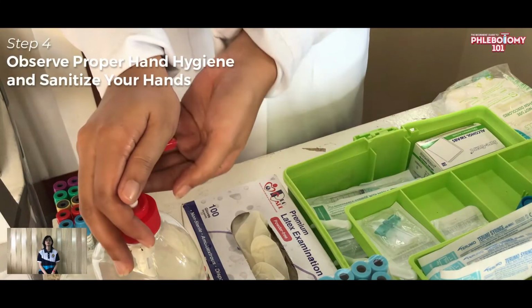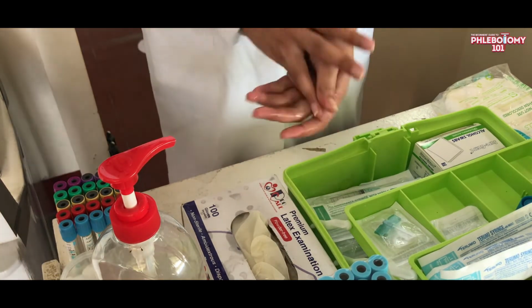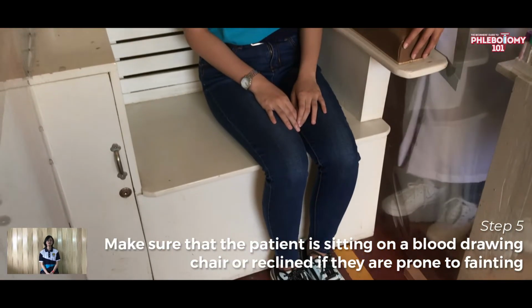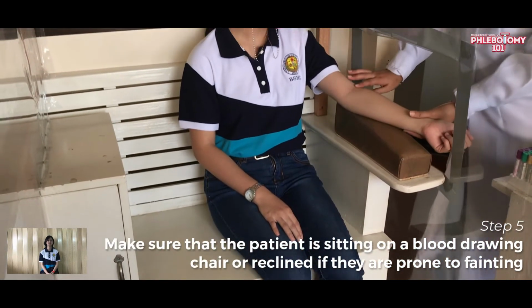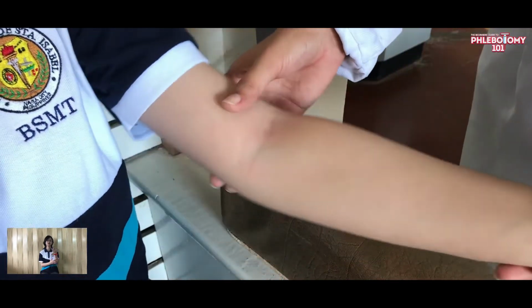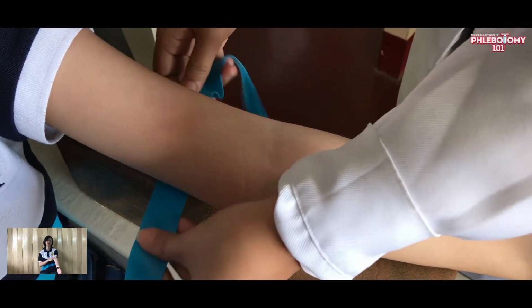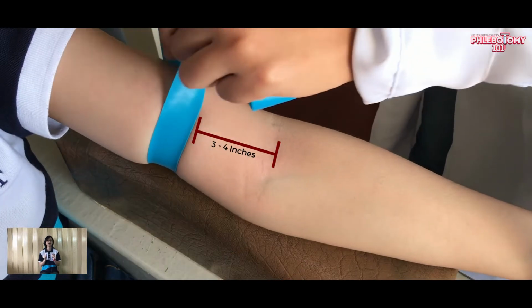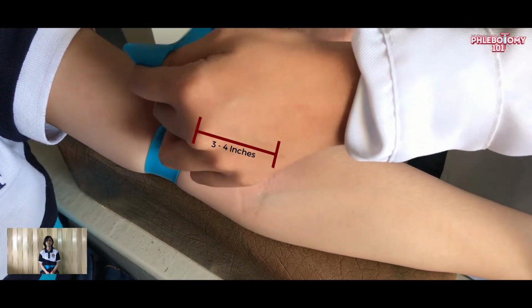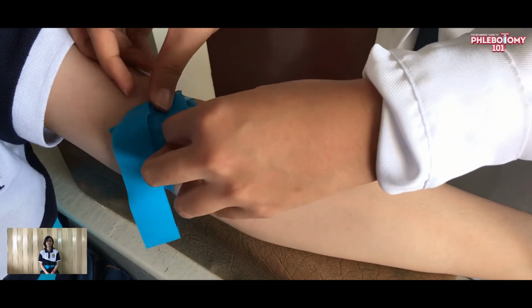Step 4. Observe proper hand hygiene and sanitize your hands. Step 5. Make sure that the patient is seated on a blood-drawing chair or reclined if they are prone to fainting. Make sure that the patient's hand or arm is well supported. Then, apply the tourniquet 3 to 4 inches from the intended side, and if the patient has sensitive skin, apply it over a gauze. Never apply a tourniquet over an open sore because it is our job to aid the recovery process of the patient and not cause them any more harm.